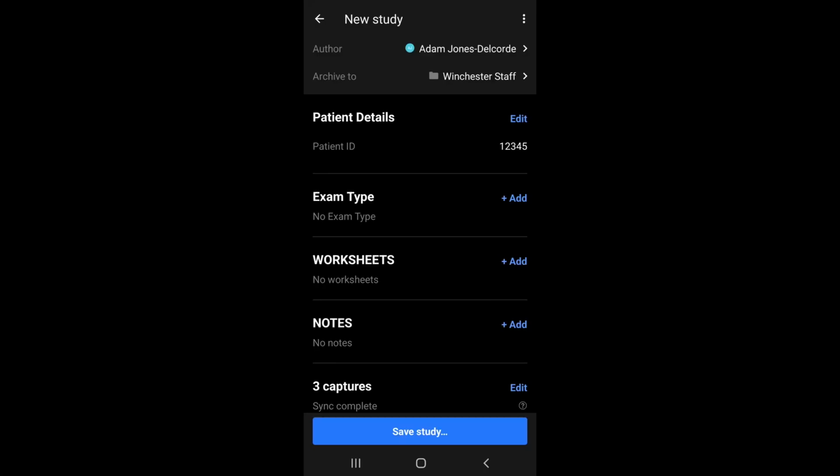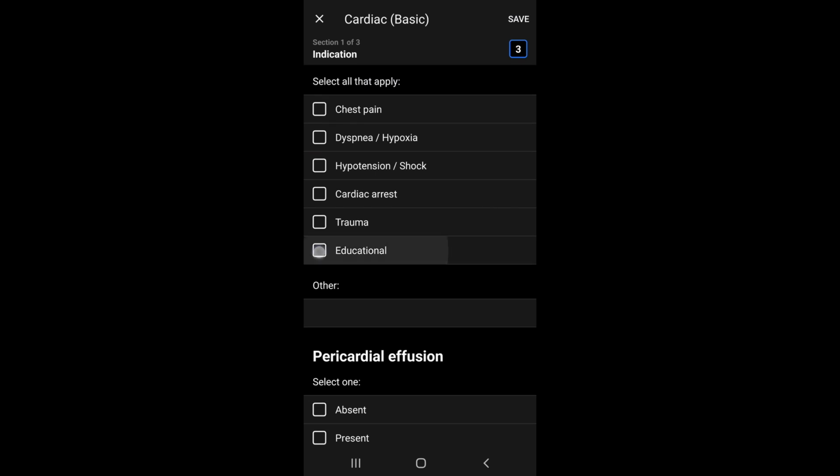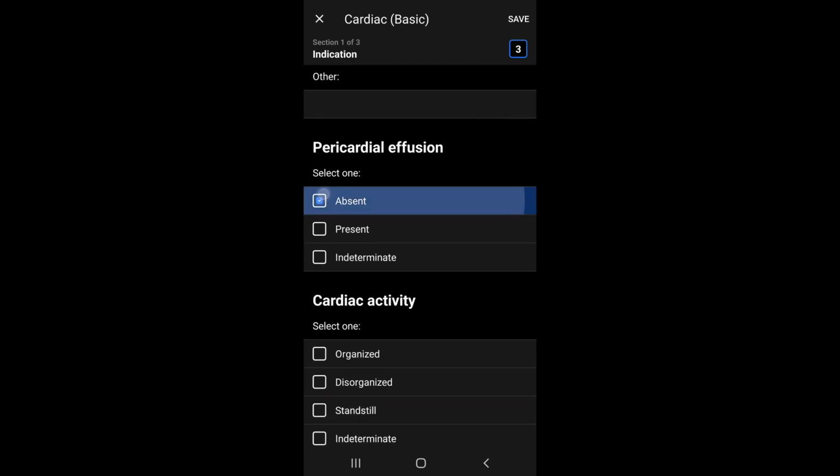Finally, if you're a resident, you've got one more thing to do. You'll have to enter your interpretation on a worksheet. Tap Add next to Worksheets, and then select the worksheet that best describes the images that you just captured. Tap through the prompts to record your interpretation, and tap Save when you're done.